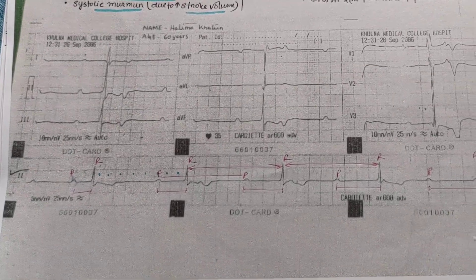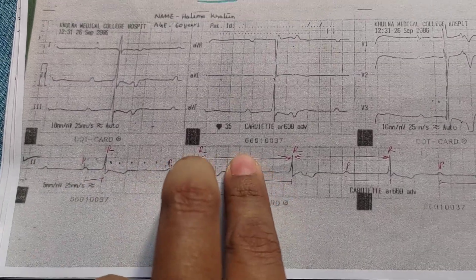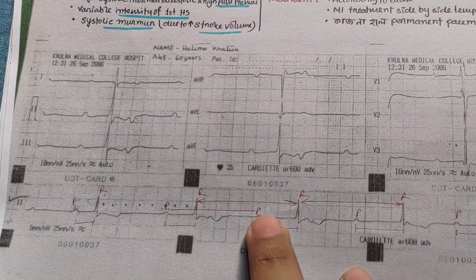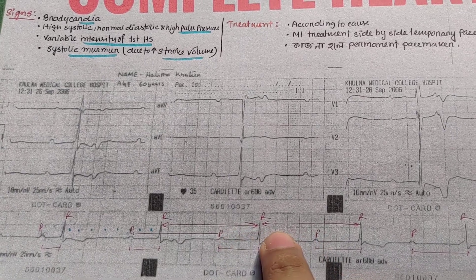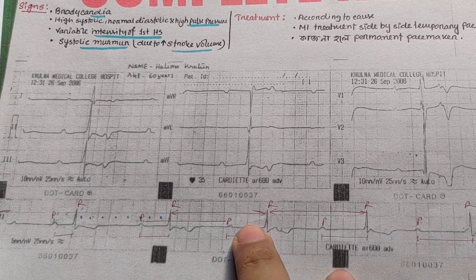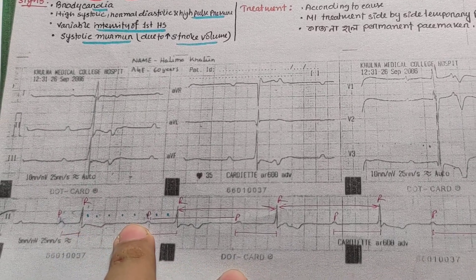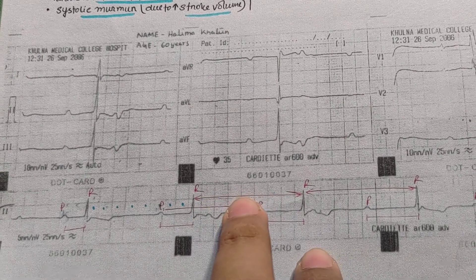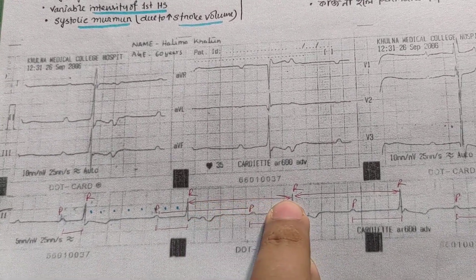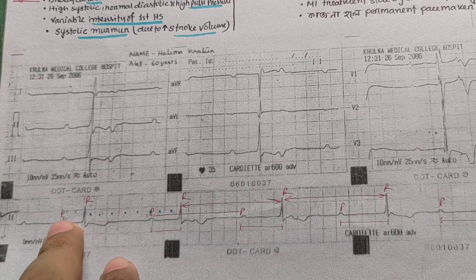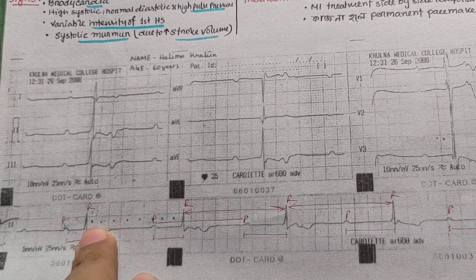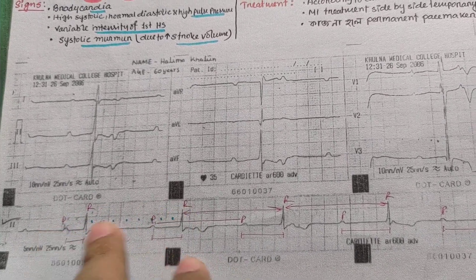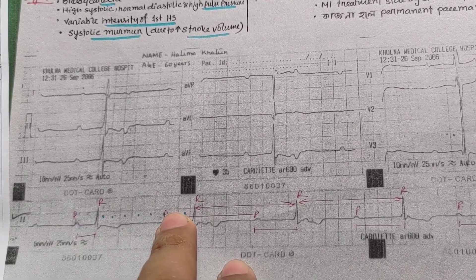What do we do? We measure the PP interval. The PP interval shows no variation — it is regular. There is a regular PP interval and regular RR interval. So the PR interval is variable, which is abnormal. The RR interval is regular and the PP interval is regular.